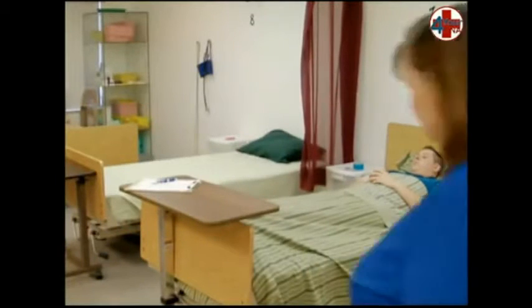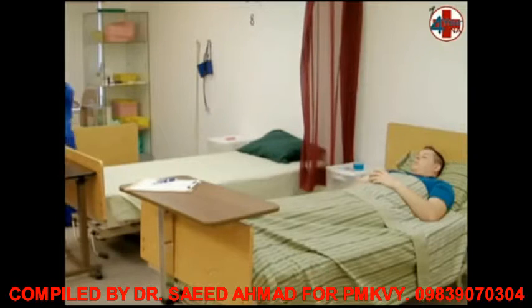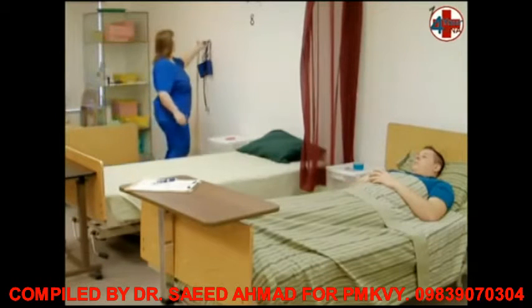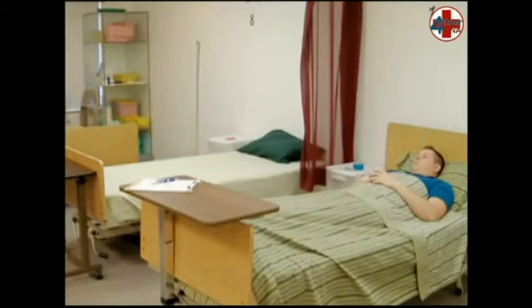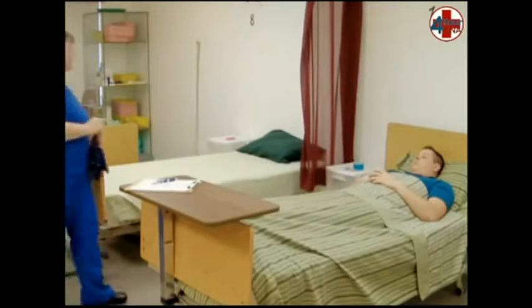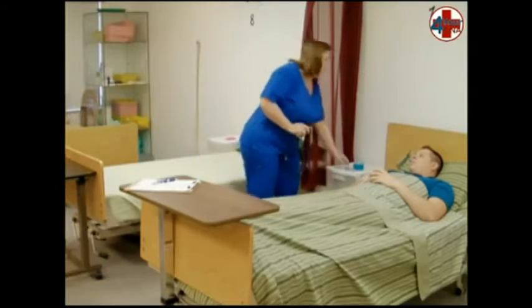When you return, gather your stethoscope and blood pressure cuff from its storage area. Ensure that the blood pressure cuff has been completely deflated. You will be using the testing center's equipment, which includes a double-sided stethoscope so the evaluator can listen as you perform blood pressure.